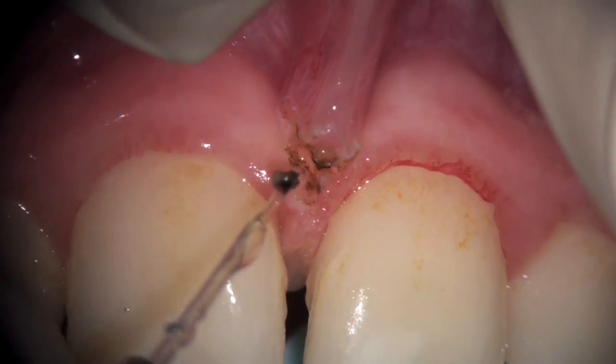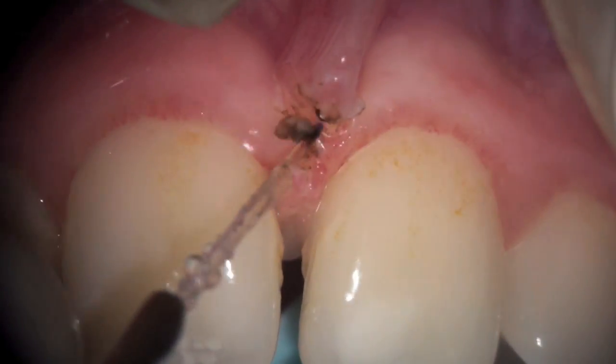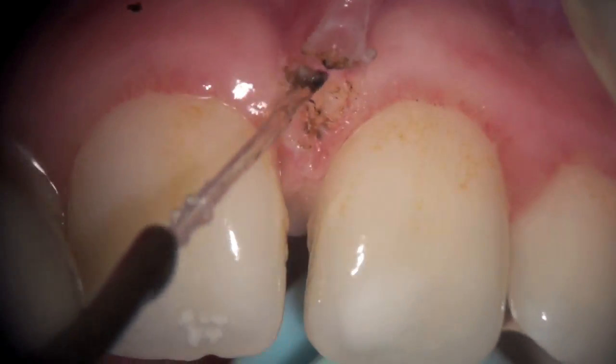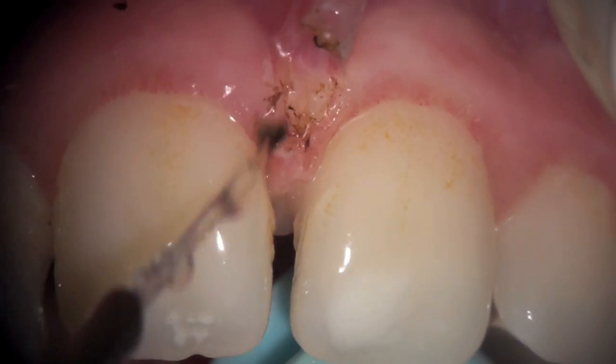We increase the power settings to five-watt continuous wave with a fine stream of water. This is a high-fluency technique, which is a little bit more advanced. As we're pulling with tension on our left hand, you can see the right-hand initiated tip is beginning to create a cut.